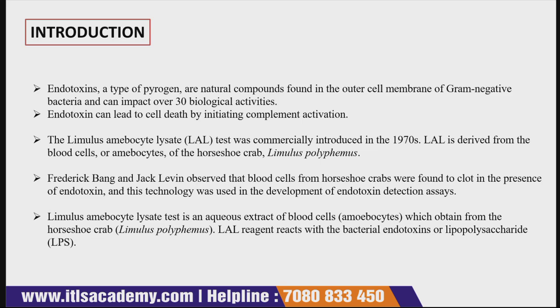Now let's move to the next, that is who is the scientist behind this discovery. So Frederick Bang and Jack Levin discovered that blood cells from the horseshoe crab were found to clot in the presence of endotoxin, and this technology was used in the development of the endotoxin detection assay.